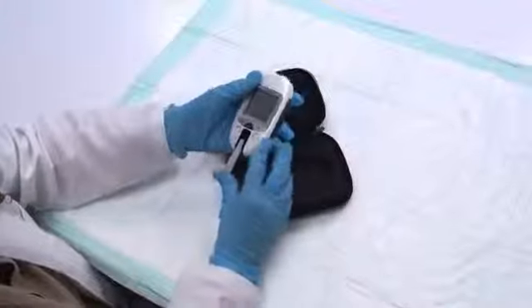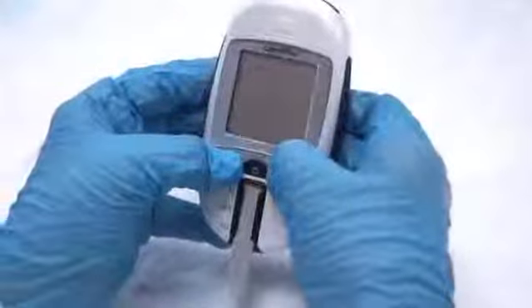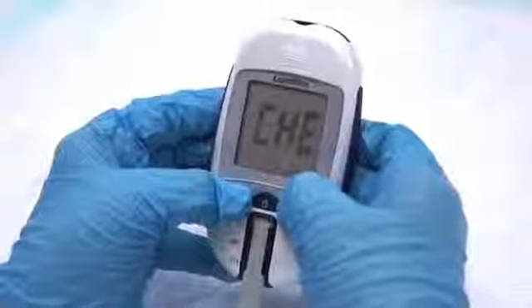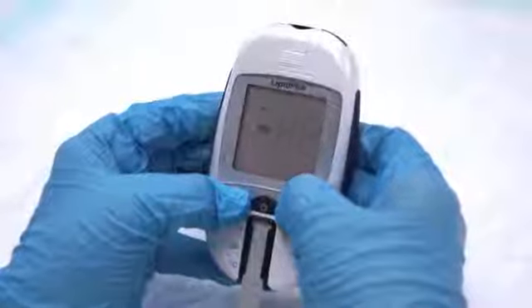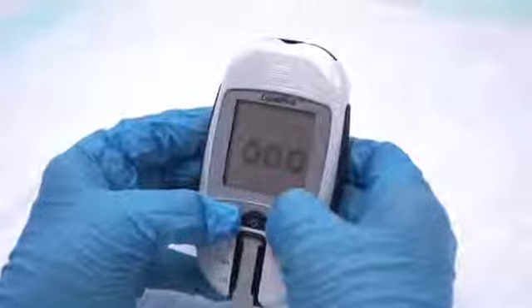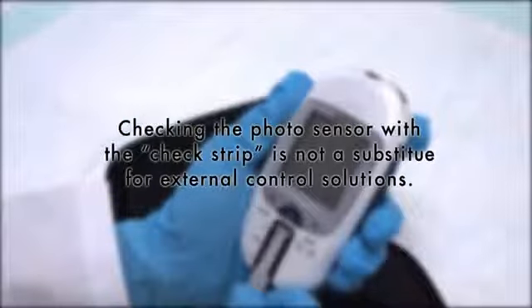To begin, insert the check strip and press both the up and down buttons at the same time for more than 3 seconds while the analyzer is in standby mode. If the analyzer is working properly, OOO will appear. If the analyzer is not operating correctly, ERR will be displayed. Checking the photosensor with the check strip is not a substitute for testing with external control solutions.